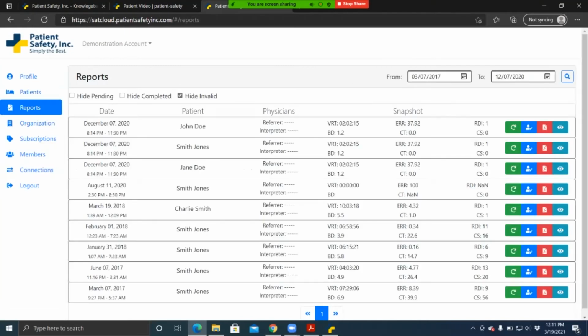The report shows all reports uploaded in chronological order of recording, not upload. So as we can see, Mr. Jones recorded something as far back as 2017. And our most recent is John Doe recording on December 7th of last year. We can make it to that patient page at any time through this reports page by hitting this blue edit patient icon. If you would like to download these reports and get the PDF, just hit this red PDF button.